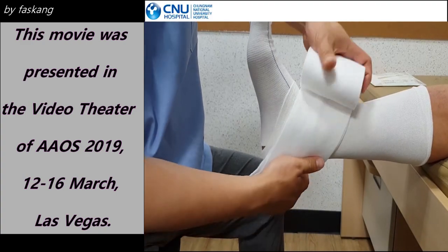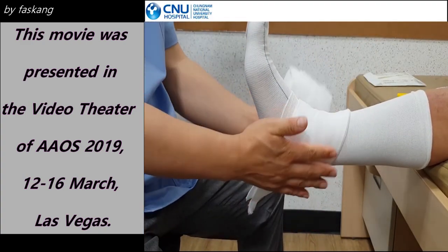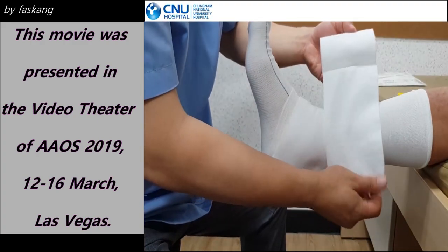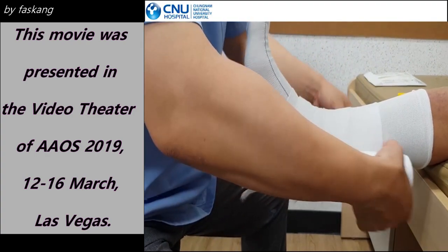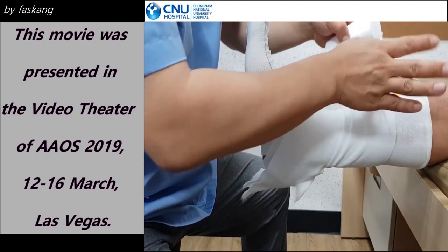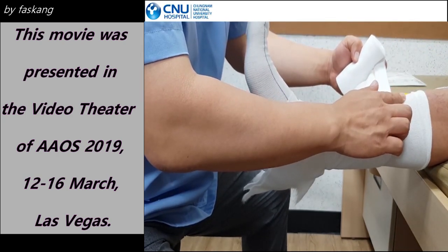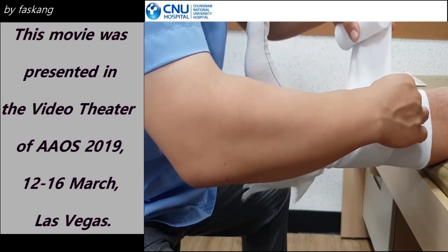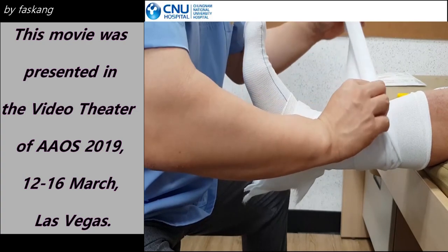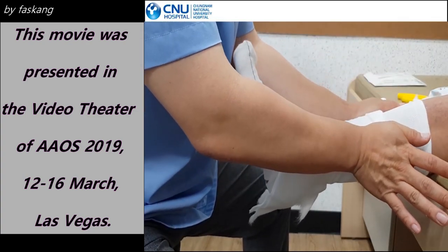The open-heel cast is applied proximally to the distal half or distal one-third of the lower leg. Some patients suffer from tibia anterior crest area pain due to impingement of the loosened cast after a decrease of edema and muscle wasting. Thus, twisting the cotton during covering to make the tibia anterior crest area covered in four layers is needed, and molding the cast to a shape where the anterior compartment of the lower leg and medial surface of the tibia are flat is necessary.